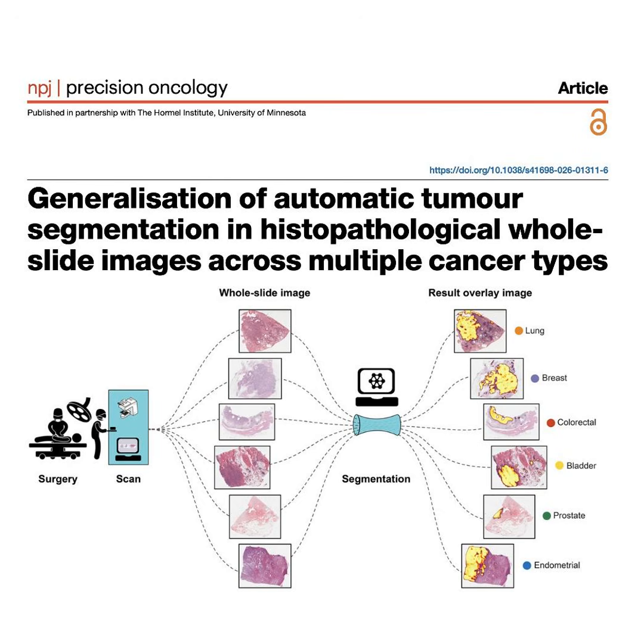Exactly. But if these tiles are nearly 8,000 pixels wide, you cannot fit a batch of 256 into GPU memory. You're probably feeding them in batches of what, like 2, 4? You've hit on the exact hardware constraint. You can only feed a very small batch of these massive tiles into the memory at once. And if you average a class of 2 students, the curve is totally meaningless. Exactly. If you try to run traditional batch normalization on a batch size of 2 or 4, the math becomes wildly unstable. The averages just swing too violently.